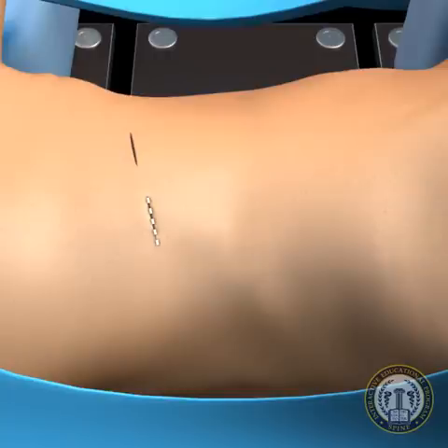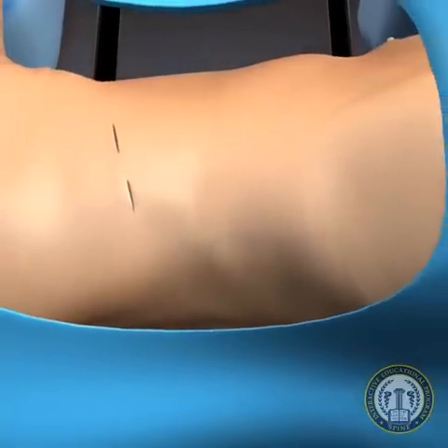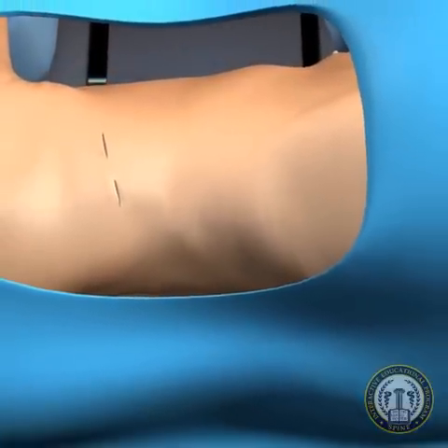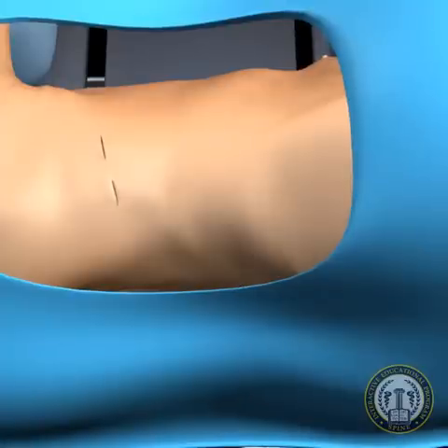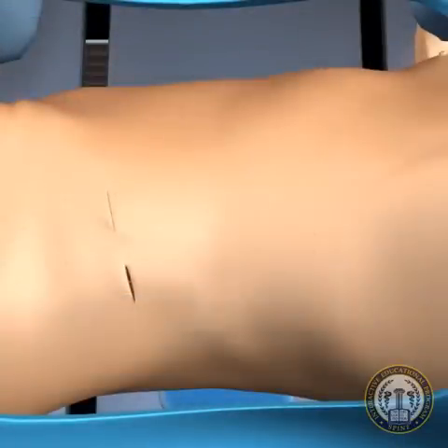This posterior lateral incision is utilized for a finger dissection approach into the retroperitoneum. The posterior incision for bluntly developing the retroperitoneal space may also be placed within the trajectory of ipsilateral pedicle screw placement in order to perform posterior instrumentation while in the lateral decubitus position.